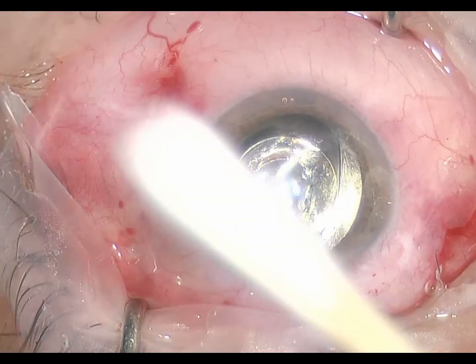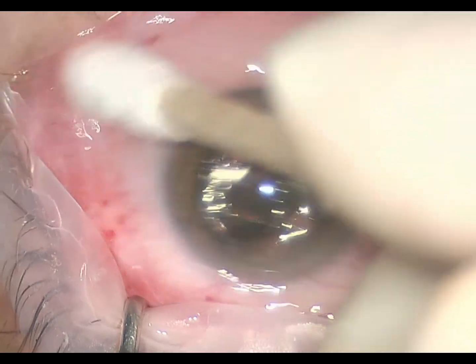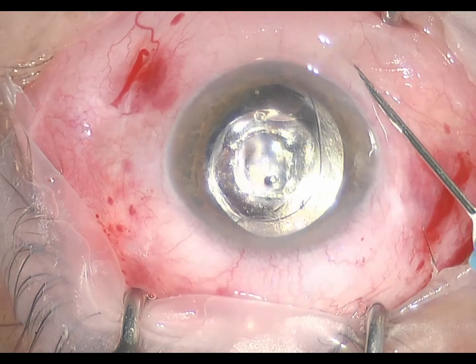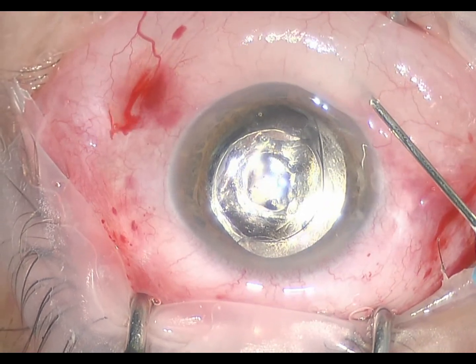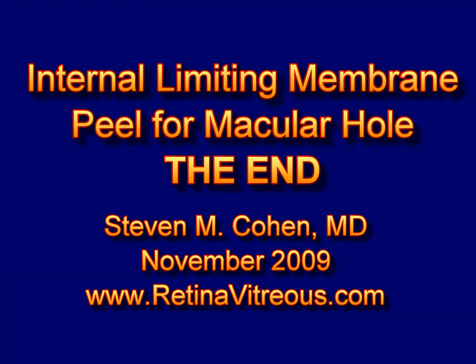I hope this surgery has been instructional. There are several others on our website, and I invite you to observe them. There are other macular hole surgery videos which show other techniques for repairing macular holes. This patient had an excellent result. The macular hole closed, and her vision improved to better than 20/40.